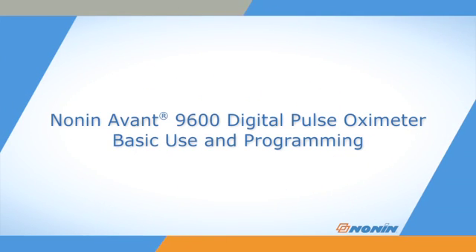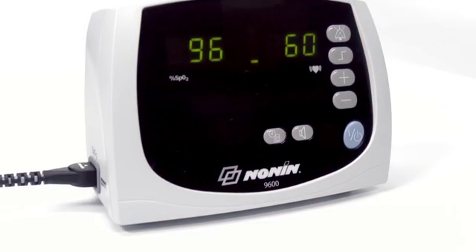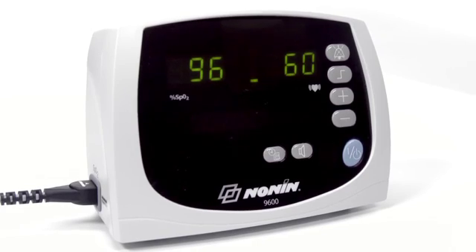This short video shows how to properly set up, connect, and operate the Nonin Avant 9600 Digital Pulse Oximeter.